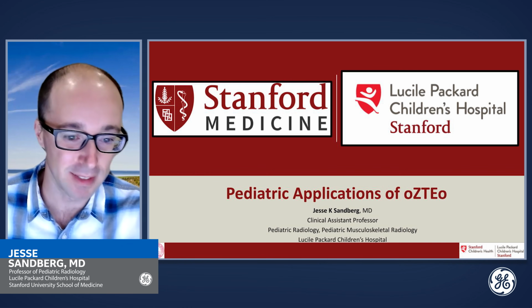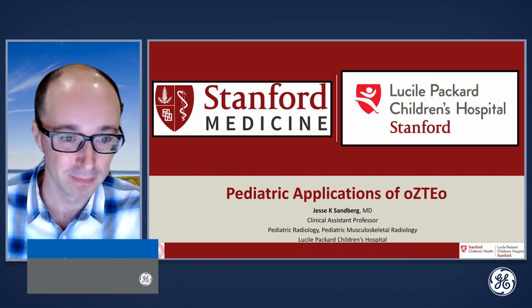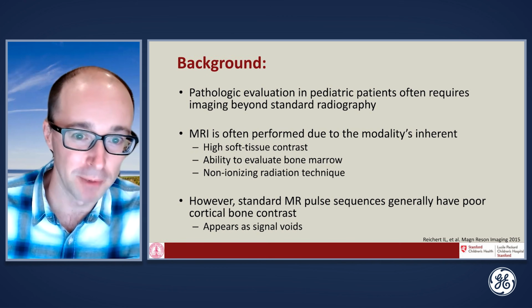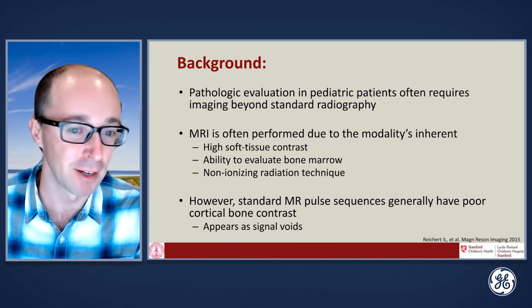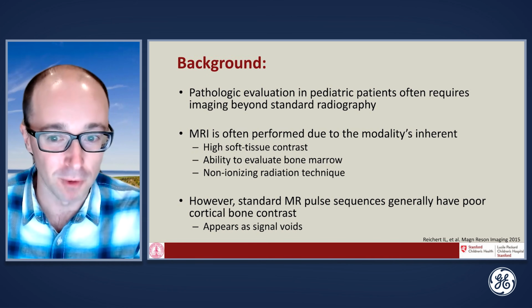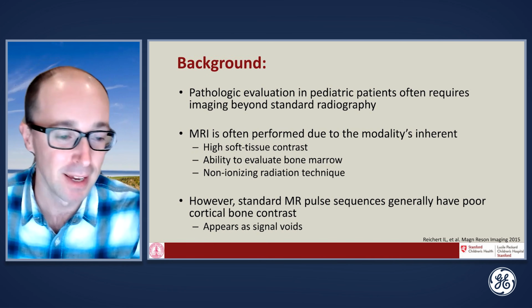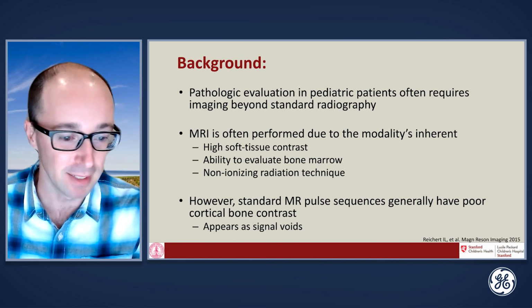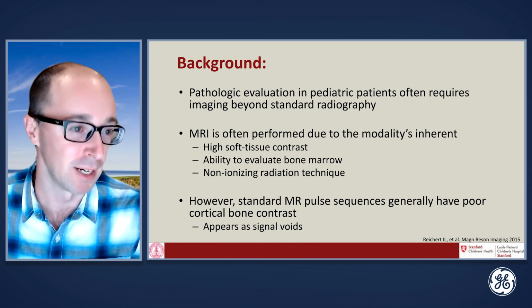Today I'll be discussing pediatric applications of osteoZTE. A little background: pathologic evaluation in pediatric patients often requires imaging beyond standard radiography. MRI is often performed due to the modality's inherent high soft tissue contrast, ability to evaluate bone marrow, and non-ionizing radiation technique. However, standard MR pulse sequences generally have poor cortical bone contrast.